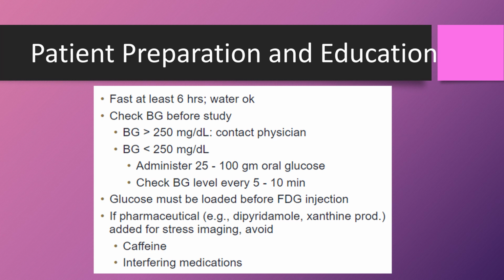Just know that if you're doing an MPI pharmaceutical study, especially if it's a PET CT MPI study, then the patient should be withheld from caffeine and any interfering medications.